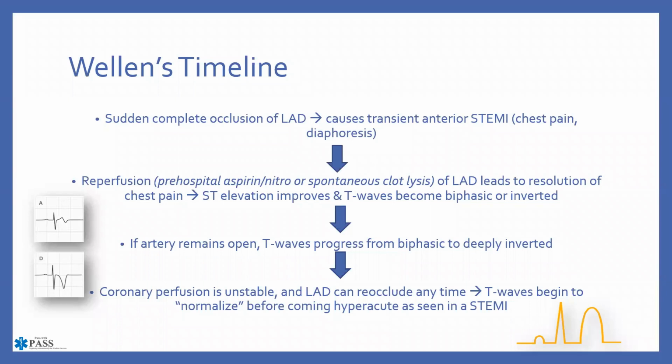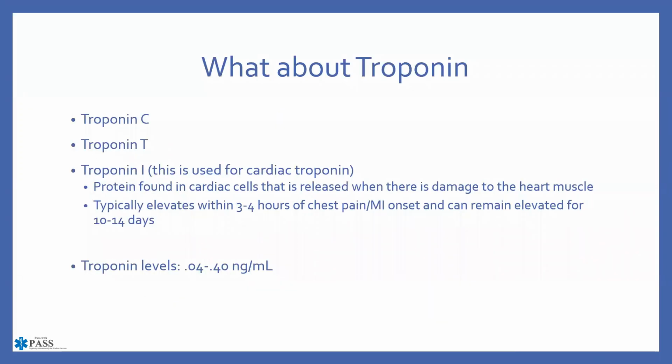So I can promise you this has happened to people that are on this lecture today. Not necessarily that there was an inappropriate treatment or you didn't transport, but we have gotten there at the time where we do the EKG and it looks normal, when in fact it really isn't normal. We just happened to get the picture at the wrong time, showing us that things had normalized when in fact they were in transition from being deeply inverted or biphasic to elevated, and a STEMI pattern being seen.